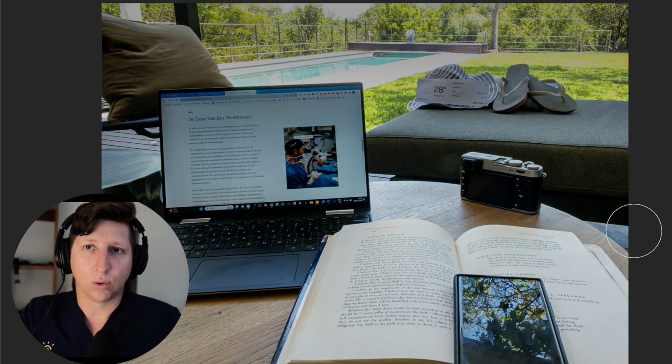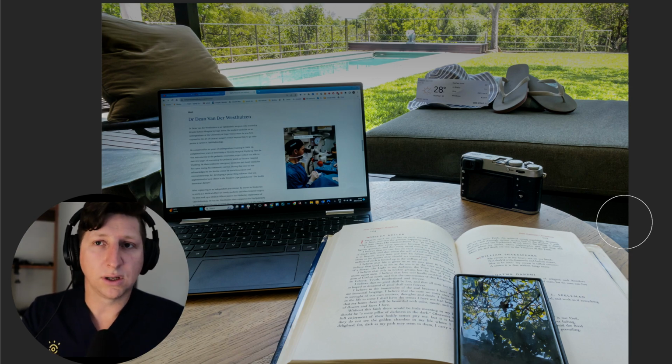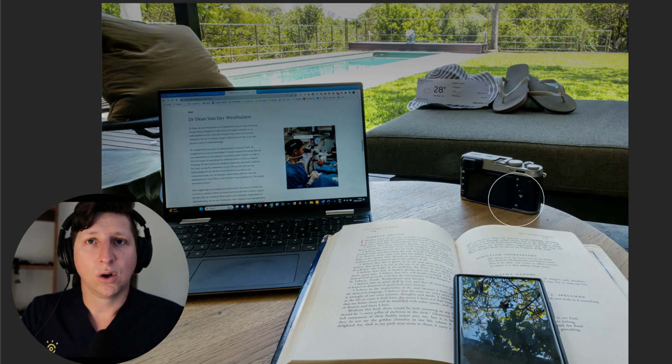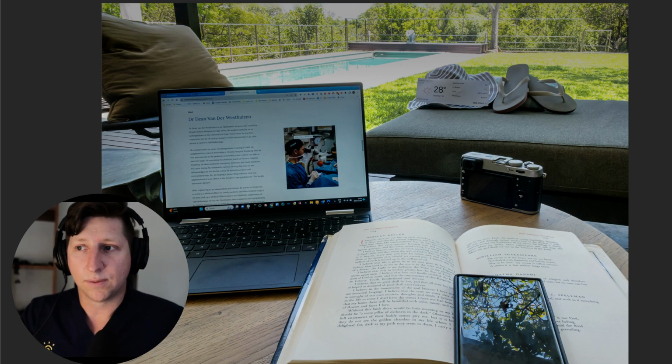Initially, it may take some time to adapt to it, and some patients struggle to adapt to it 100%, but most do. In this scenario, one can see in the distance and one can see near, and your need for reading glasses is very limited. So that's monovision.